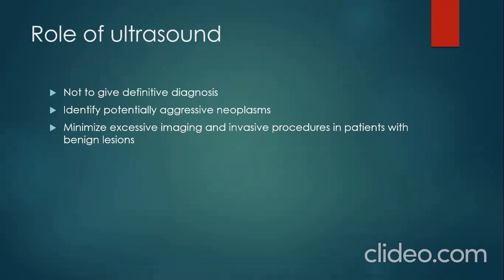So what is your role as a sonographer? What is the role of this ultrasound modality? The role is not to give the definitive diagnosis, but do not quote me wrong. I'm not saying that ultrasound cannot give a definitive diagnosis in lumps and bumps, but that is not its main role. But in some cases, we might be able to give a definitive diagnosis. But its main role is to identify potentially aggressive neoplasms so that we minimize excessive imaging and invasive procedures, especially in patients who have benign lesions.